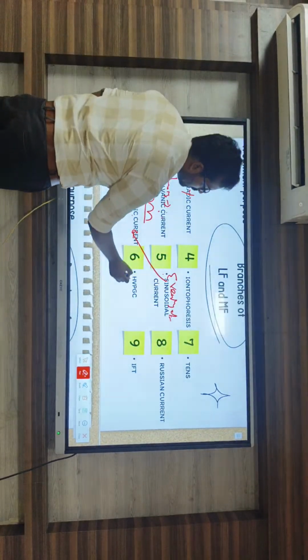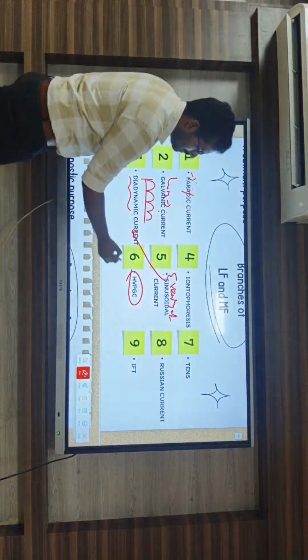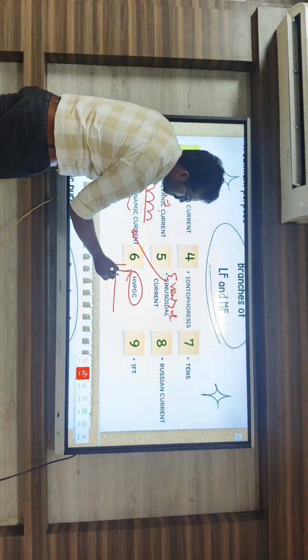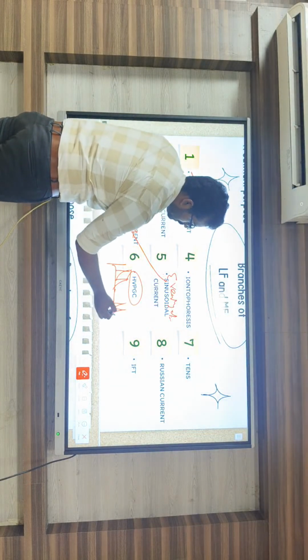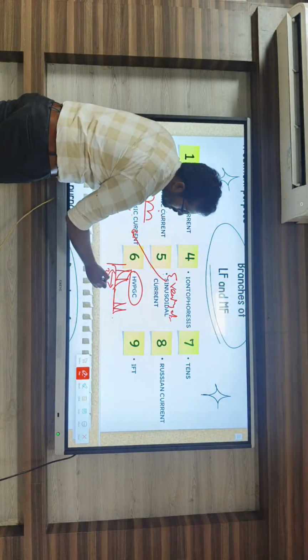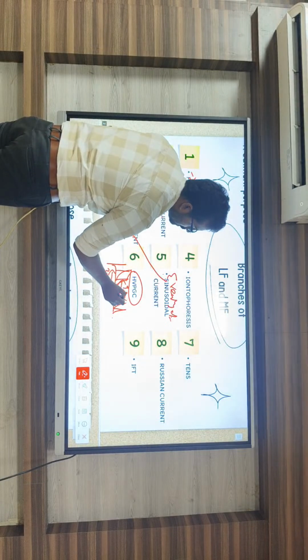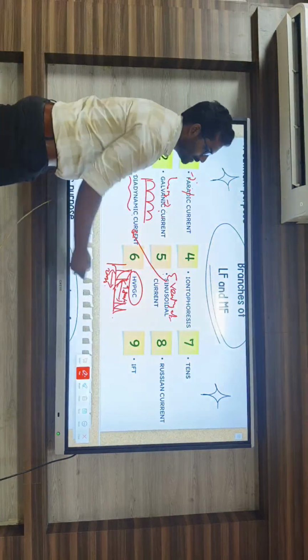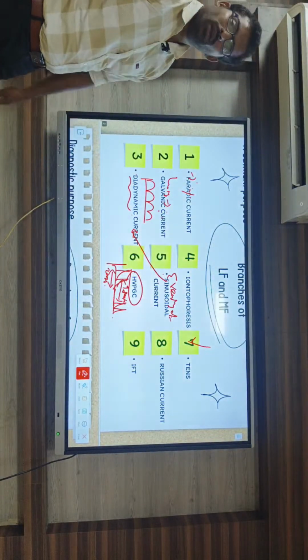And the high voltage pulsed galvanic current is the twin peak pulsed monophasic current. The pulse durations are 200 µs and interpulse intervals are 9800 µs. So these currents come under the low frequency currents.